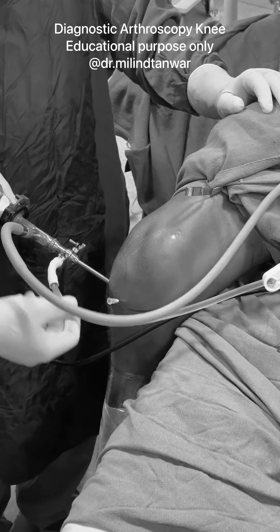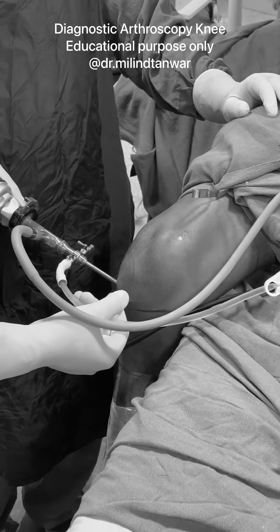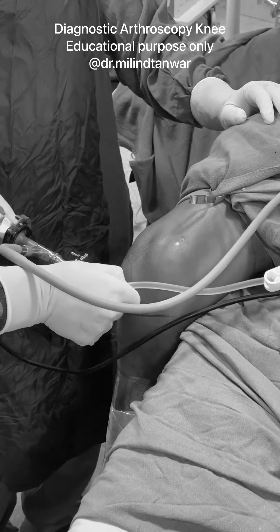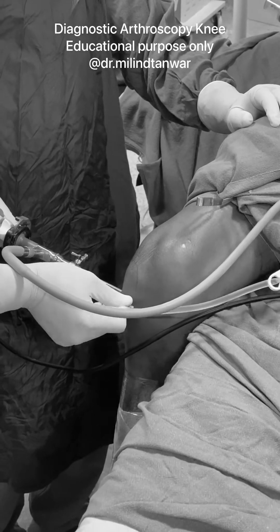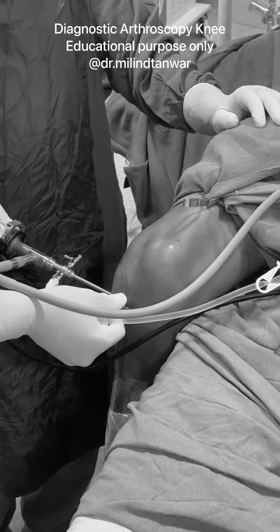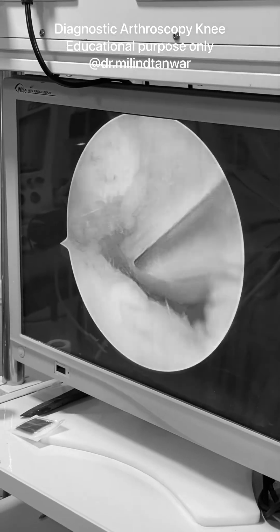Once you insert the needle, you have to go straight down. You don't have to go towards your scope or towards the notch. Once you go straight in, you can feel the needle touching your scope somewhere inside. This is exactly the needle as it is coming in the video, so you can manipulate it. You can see that needle coming in.